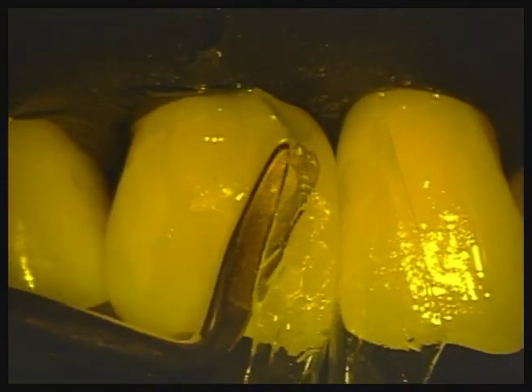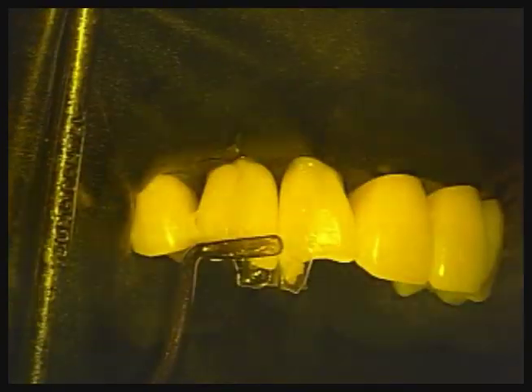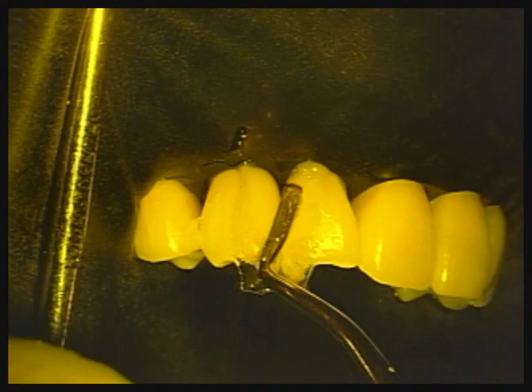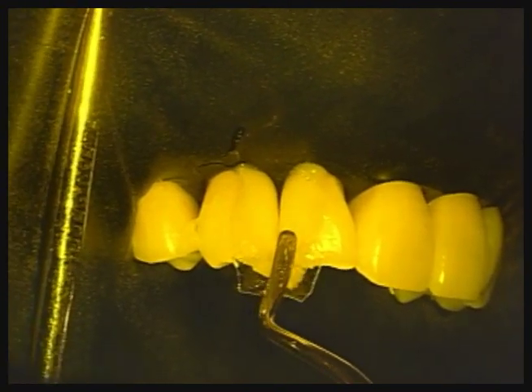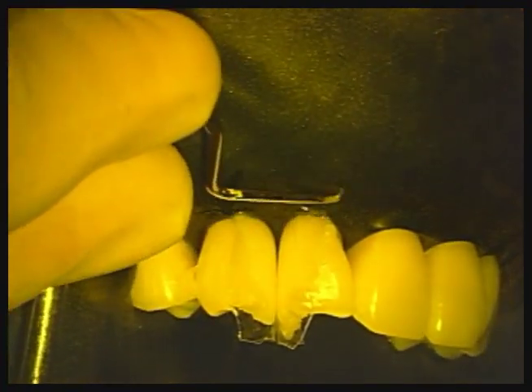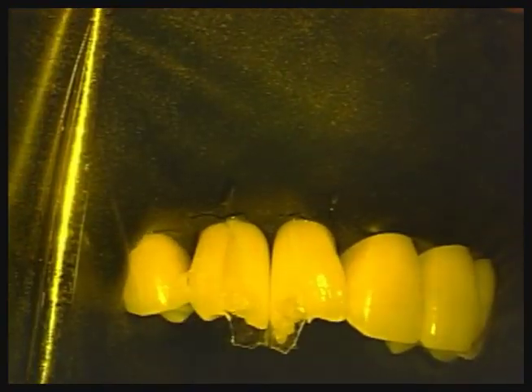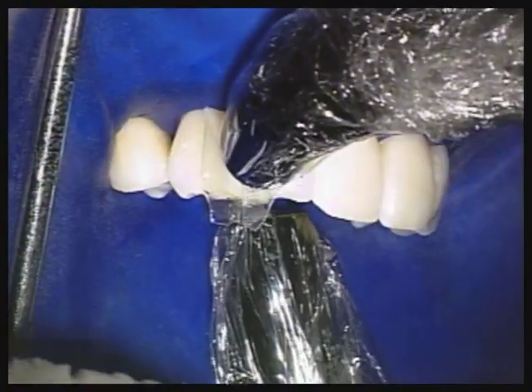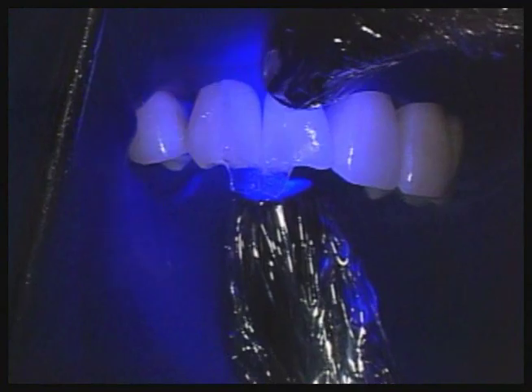When performing injection molding, the bonding resin, flowable, and paste composites are cured altogether instead of curing them individually. These anterior matrices from the pink kit have between 0.5 and 0.75 millimeters of cervical curvature. Use several dry brushes to blot away the excess flowable composite and bonding resin in the gingival sulcus.